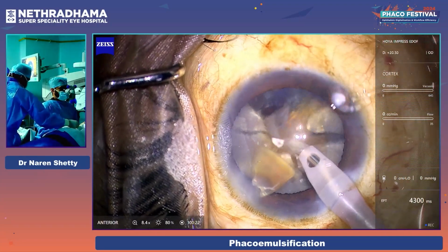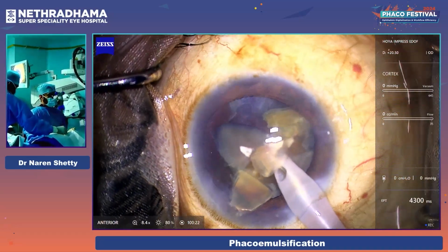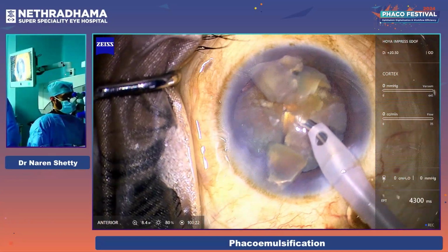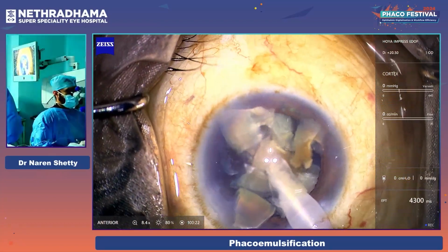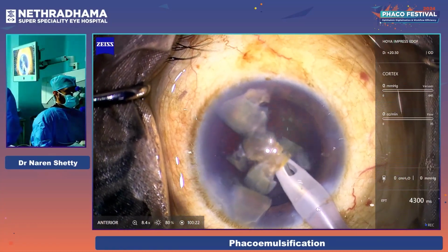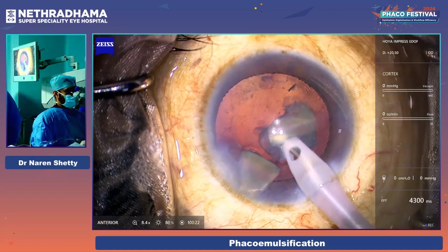What is important is whenever you press step 3, see the level. I'm at the level of the iris. I don't move my phaco probe so that my cornea is nice and clear. And look at the ease with which it's able to eat even in these hard cataracts. It's very, very simple. The key is to do as small pieces as possible. Look at the light, sir. It's important to make sure the eye is facing up at all points. Because if the patient is looking up or in some other direction, the plane at which you're phacoing is different. If you look at the stability, it's completely rock solid.